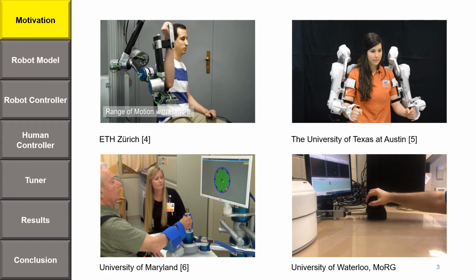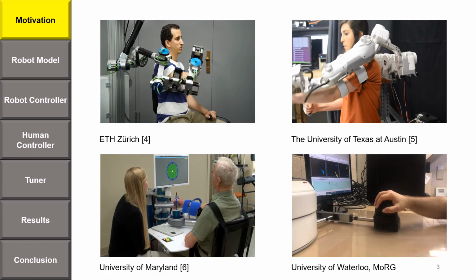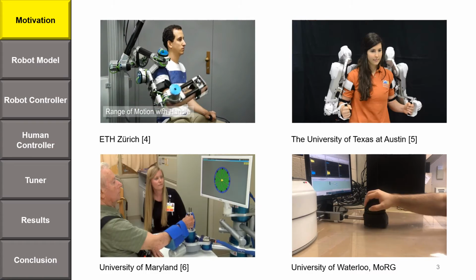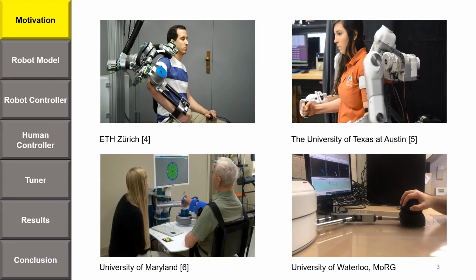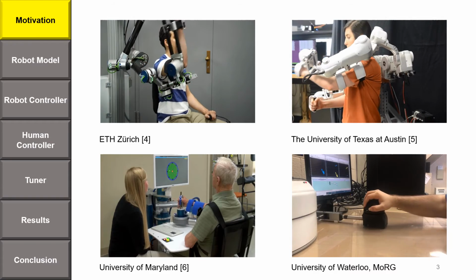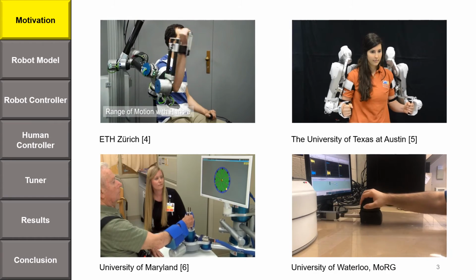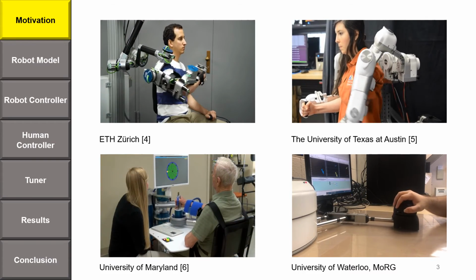In addition to the automation, the data from measurement devices on these machines can be used to quantitatively and objectively evaluate the patient progress. With recent capabilities of virtual reality devices, robots can also be equipped with VR systems to make the rehabilitation more engaging for the elderly population. As a result, robots are a good complement to traditional clinical therapy.